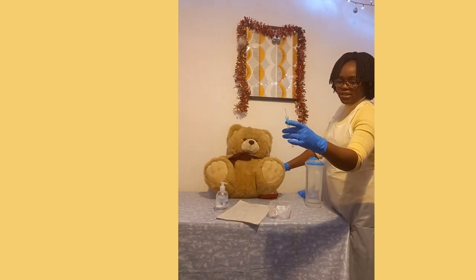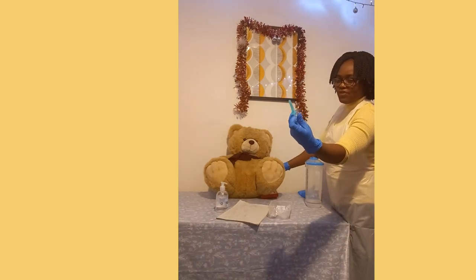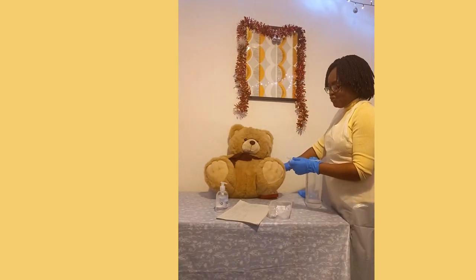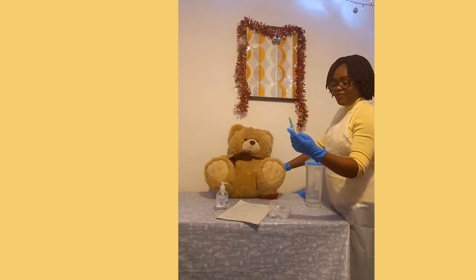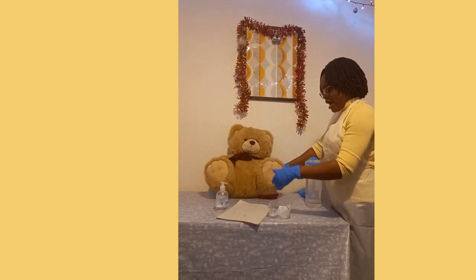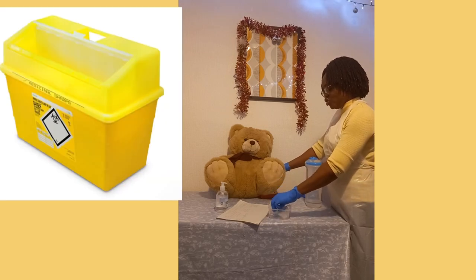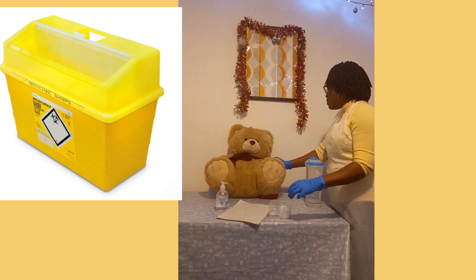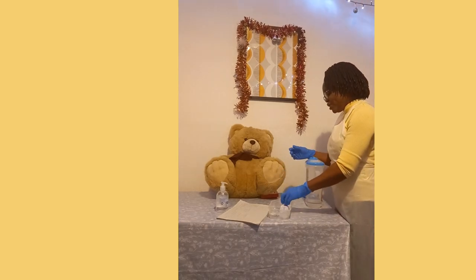I'm going to apply gentle pressure without massaging the site, and I will be activating my safety lock. This is the safety lock — you activate it by raising it up and pressing it, and it is already activated. I discard it inside my sharps box. However, if you didn't go with your sharps box, after activating the safety lock just put it inside your tray. I can see that the site is not bleeding. How do you feel now, Malcolm? Are you all right? I'm okay.